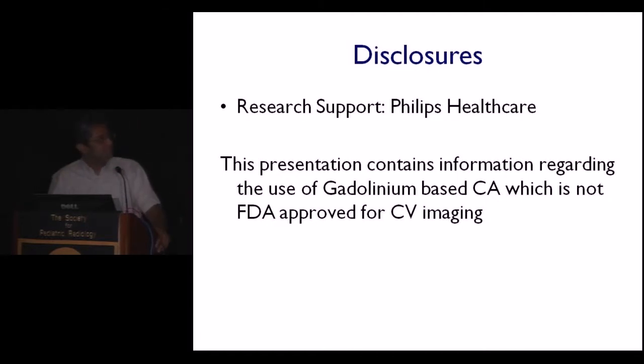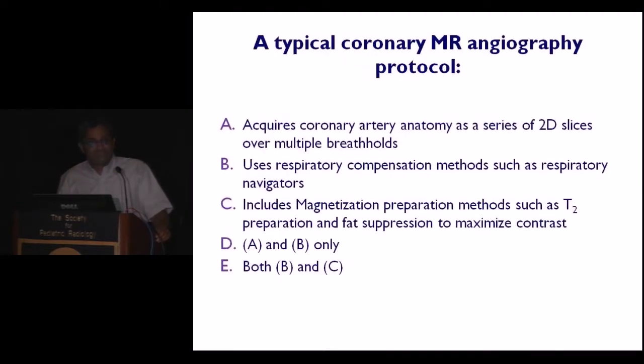So all the lectures that you've heard so far are all 2D imaging. For those of you who are new to MR, there is a fundamental difference between 3D imaging in MR compared to CT or ultrasound or other imaging techniques. The key difference is that in conventional 2D imaging, we collect a number of phase encoding steps to make one image. When you do 3D imaging, we actually excite an entire volume for each TR.